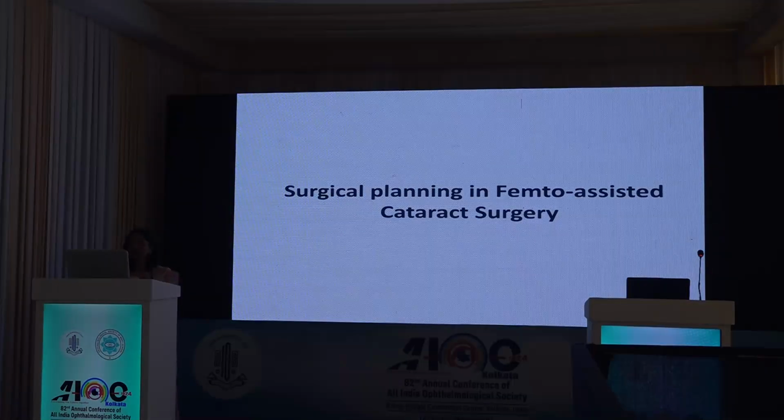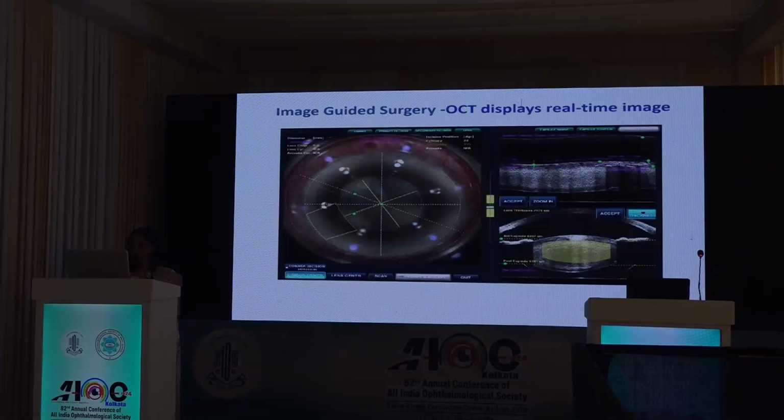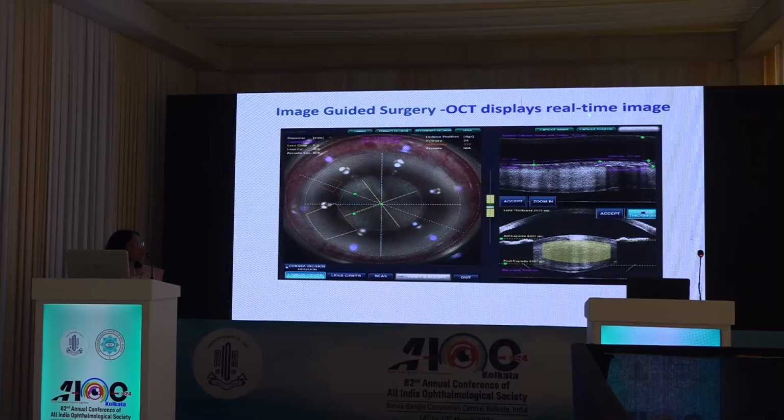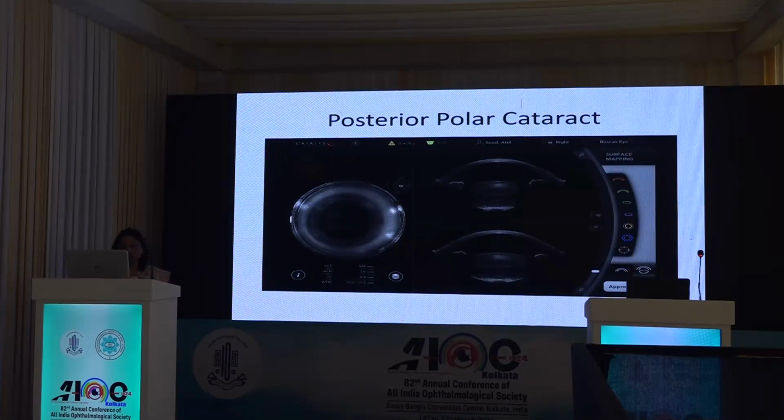Now, the most recent advancement in cataract surgery is femtolaser assisted cataract surgery. All the systems have real-time OCT integrated in them. So we can visualize the whole of the anterior segment, and it is especially useful in the posterior polar cataract, where you can see the pre-existing PC defect just before doing the laser treatment, and you can reduce the area of lens fragmentation to leave an epinuclear cushion behind.